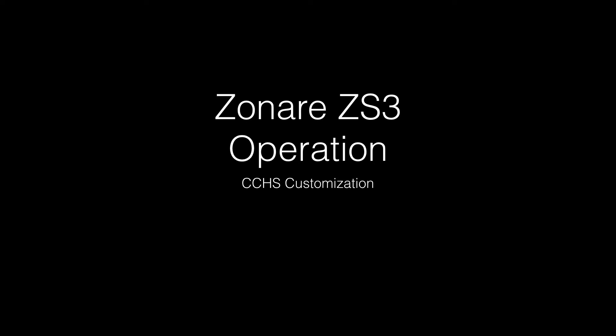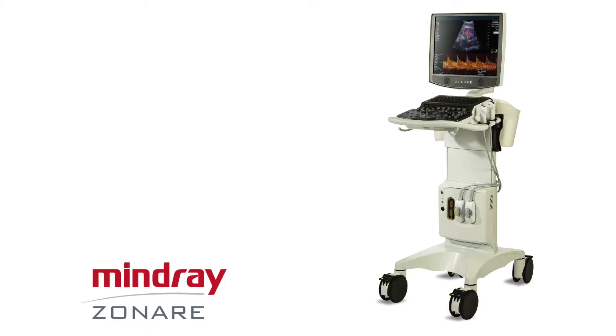This is a short video reviewing the basic operations for the Zonare ZS3 system with the CCHS customizations. This is a system made by Mindray Zonare. You can see an image of the cart-based system here.